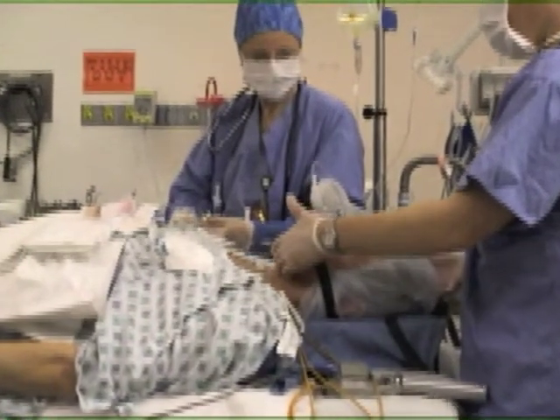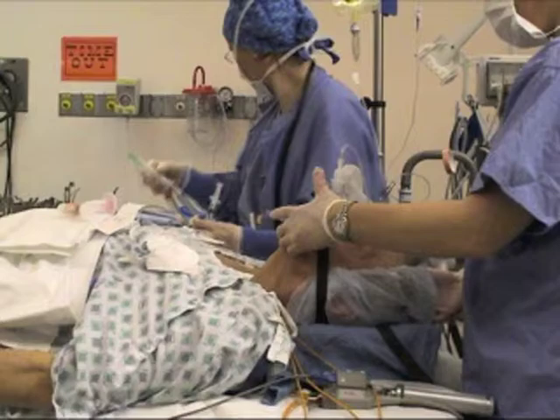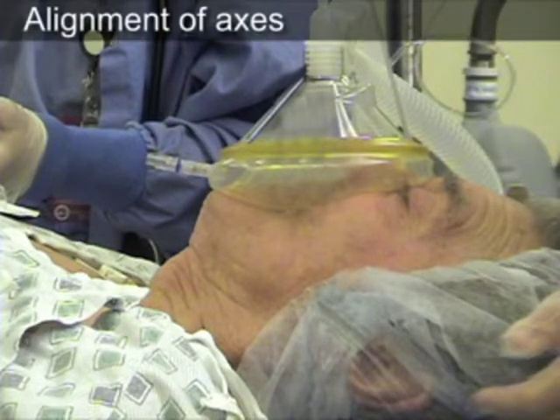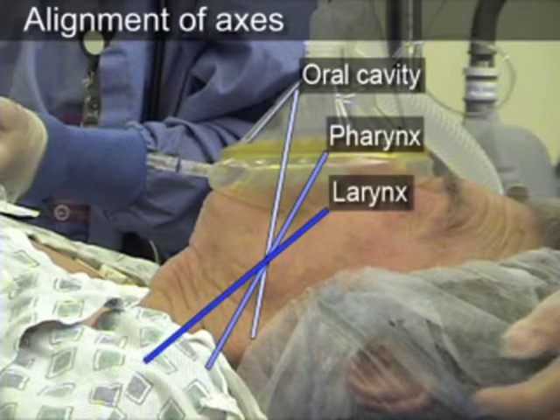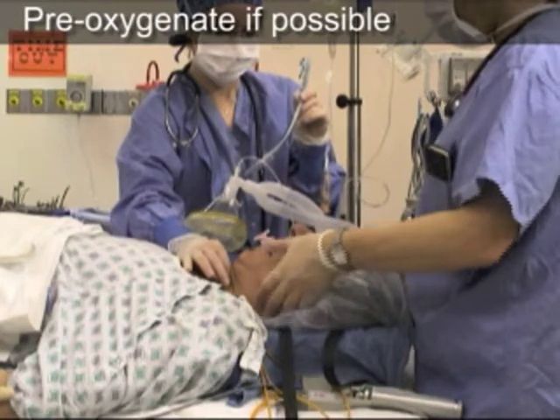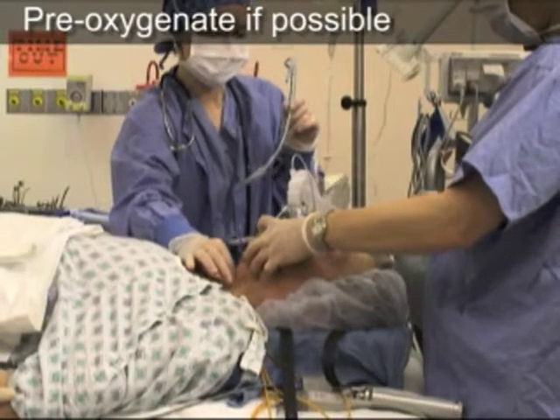Adjust the height of the bed so that the patient's head is level with a lower portion of your sternum. Unless contraindicated, place the patient into the sniffing position by placing a pillow or folded towel under the patient's occiput. This combination of flexion of the neck and extension of the head improves the alignment of the axes of the oral cavity, pharynx, and larynx, facilitating optimal visualization of the vocal cords. If the clinical situation allows, pre-oxygenate the patient with a non-rebreather mask or a bag valve mask with 100% oxygen for at least three minutes prior to the intubation.